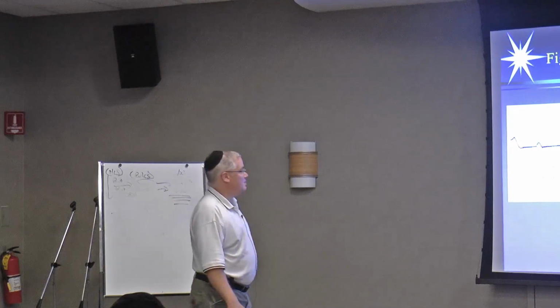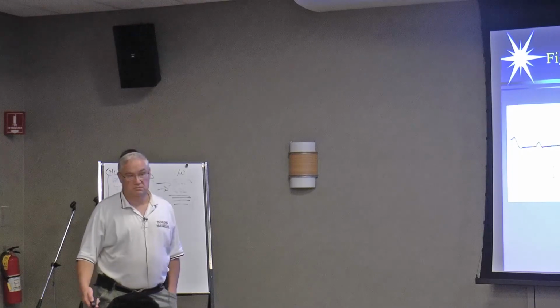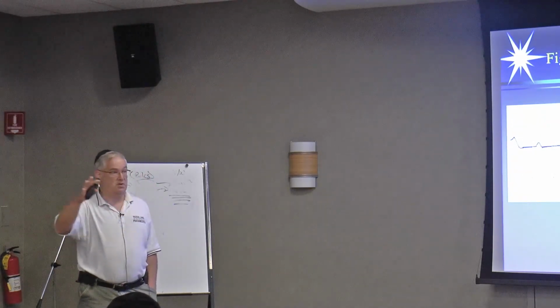So that's what will happen if you have somebody in a complete heart block and you're treating them, rushing them to the hospital, and they become unresponsive. You'll probably come over and just see P waves going across the screen.